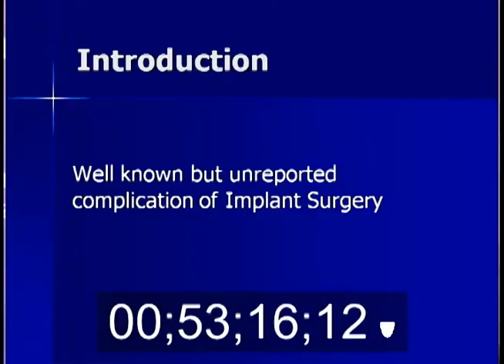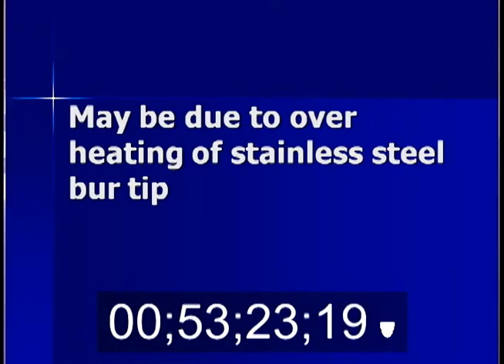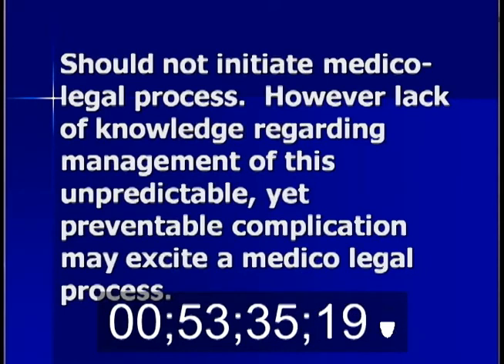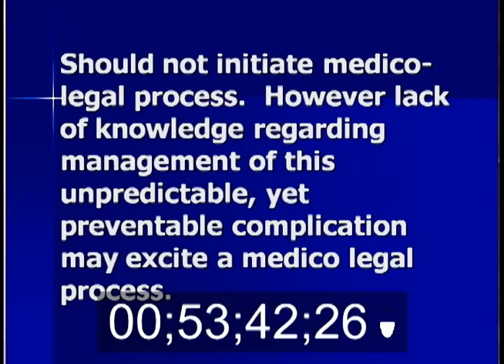Now, this is a well-known but unreported complication of implant surgery. It may be due to overheating of the stainless steel bur tip. And there is a dearth in the literature regarding the management of these cases. Now, it should not initiate a medico-legal process. However, lack of knowledge regarding management of this unpredictable yet preventable complication may excite a medico-legal process if you do not know what to do.